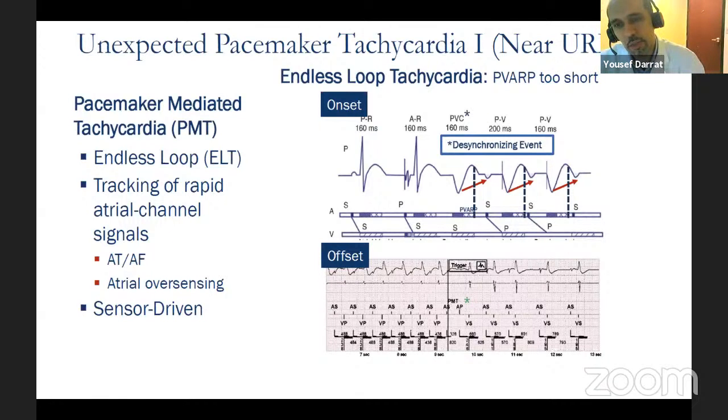Khalid, let's give the second question to Khalid, abandoned lead, MRI. He's smiling. It's very easy. I think I will call your radiologist the following day. He's clearly very upset you called him in the middle of the night. In my opinion, it depends on whether the lead is MRI compatible or not. If it is abandoned, I think some people will be concerned about whether it will migrate if you do the MRI. It's unlikely, especially if it's been there for a long time.